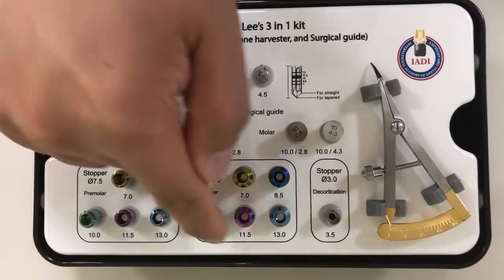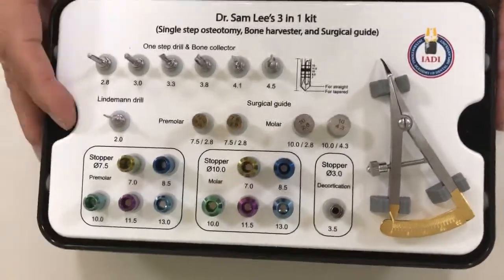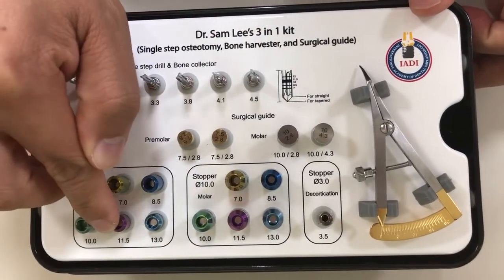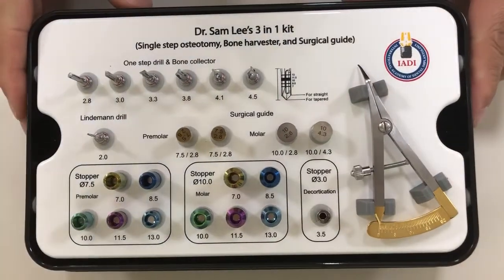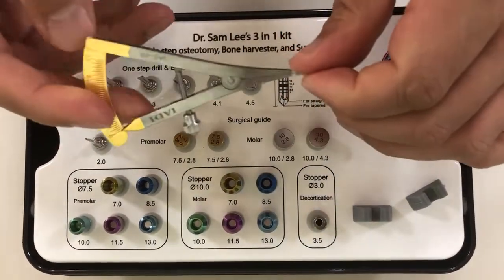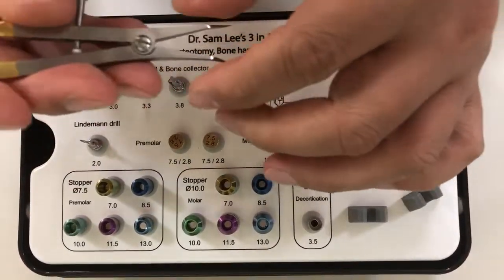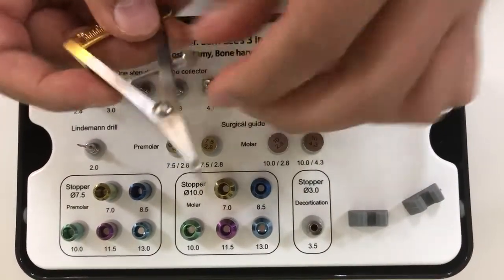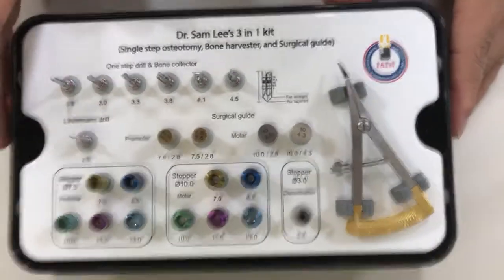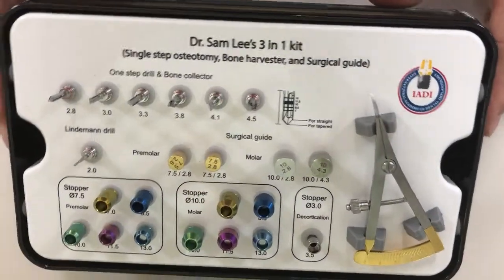It gives us horizontal mesial-distal dimension as well as a vertical stop. The available lengths are 7.0, 8.5, 10, 11.5, and 13 millimeters. I also have a caliper that I like to use for measuring gingiva incision design, which I will talk about in detail later on.